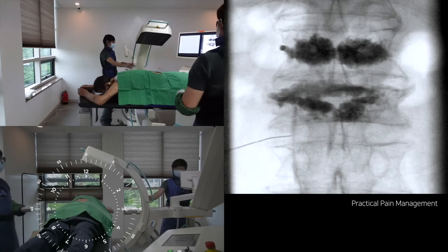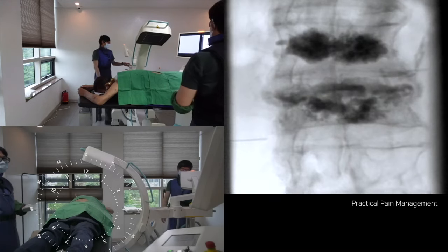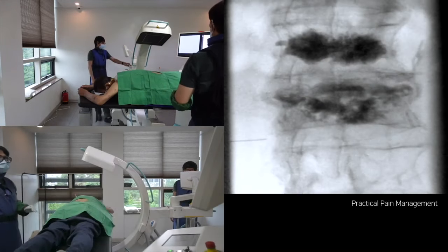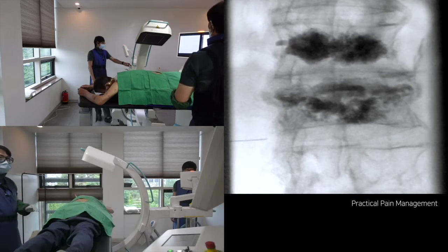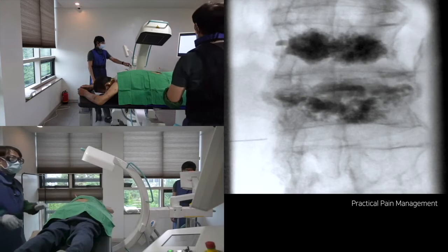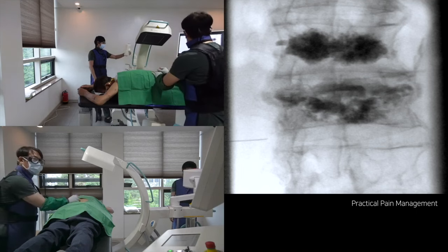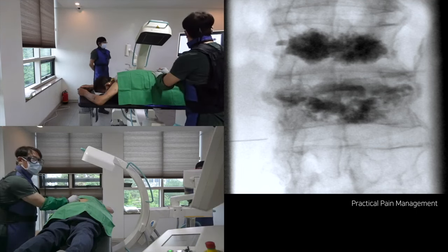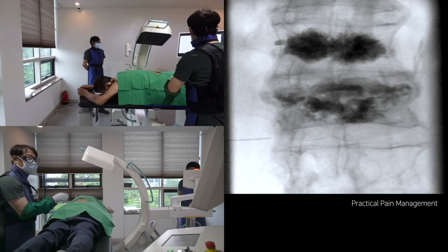Let the C-arm rotate to the contralateral side — it is about five degrees of rotation. Advance the needle slowly to the overlying bony shadow of the lamina in the upper lumbar region.